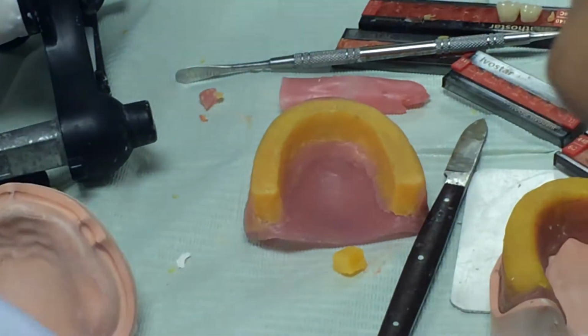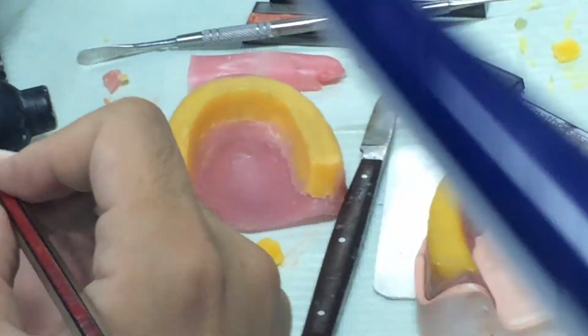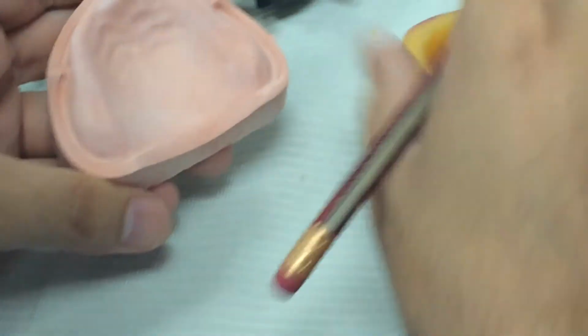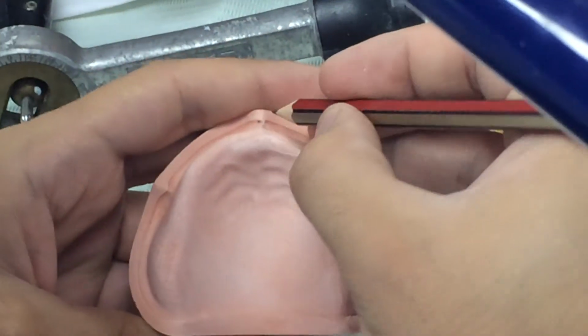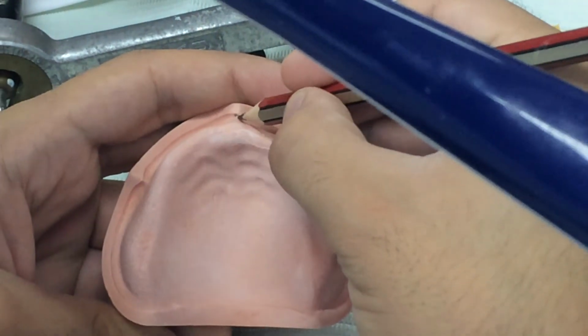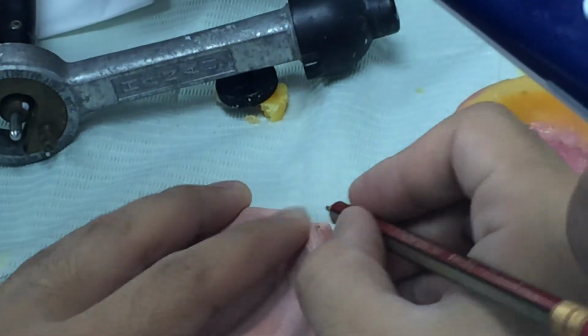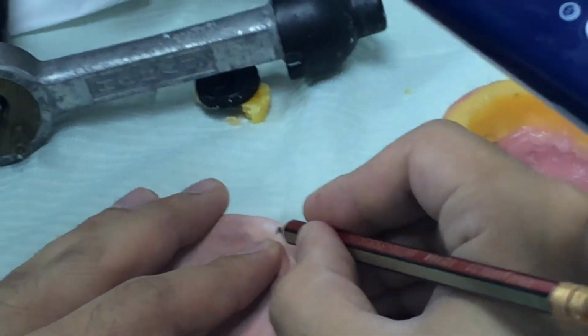Guys, you remember we just asked how to determine the midline, right? So the midline doesn't come from this. This is what we call the frenum. We have to find where the incisive papilla is.